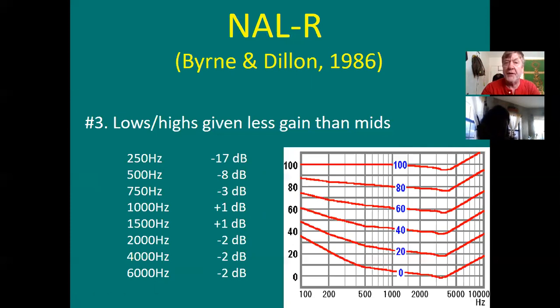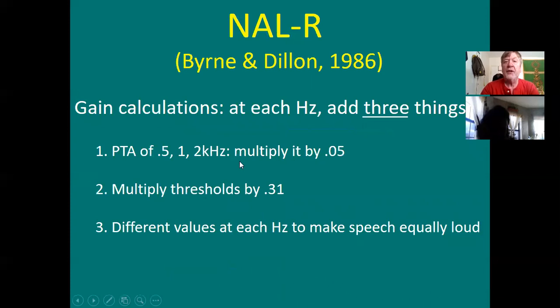So if you've done this one, and this one, you have now come up with your NAL target for that fitting method.